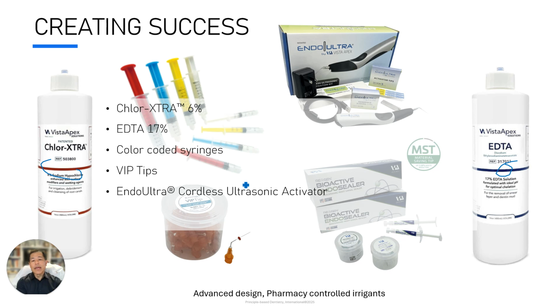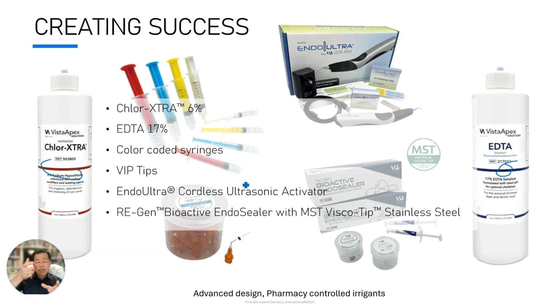That irrigant, then we do activate it with the Endo Ultra cordless ultrasonic activator, and then we use the Regen Bioactive Endo Sealer with the MST, the material saving tip. And I like the stainless steel tips because I can get them into the canals easier, and I can kind of feel where I am in the canals. What I'll do is start expressing it gently, and as I express it, I will withdraw it from the canal. Then gently I'll take a single gutta percha point and place that into the canal.